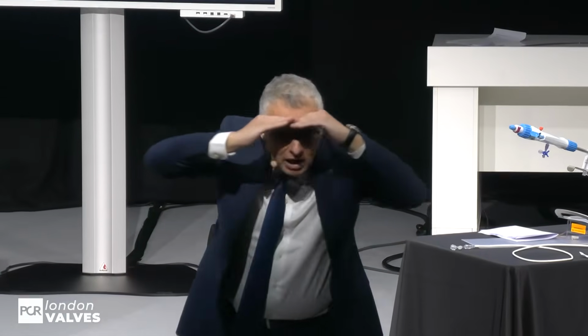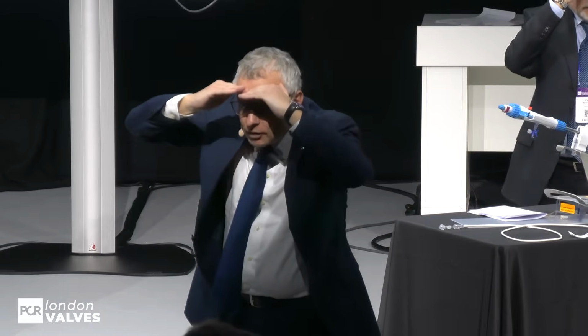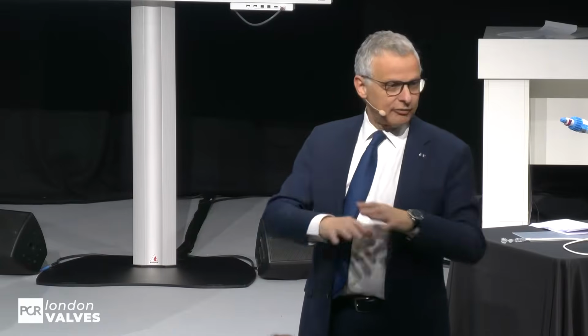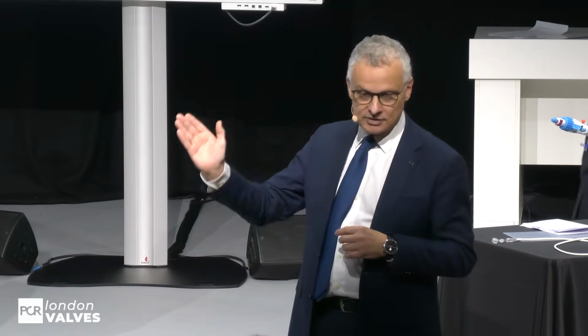So who is doing TriClip here? Who is doing tricuspid interventions? Don't be shy, even if you've done only one. Okay, so who would go, let's take the second. The first is probably a bit less common. Second case, functional TR, it is probably ventricular, because we have seen tethering. The TR is broad. Who will go for two clips in the anteroseptal? Who would go for a clover-like anteroseptal and posteroseptal?